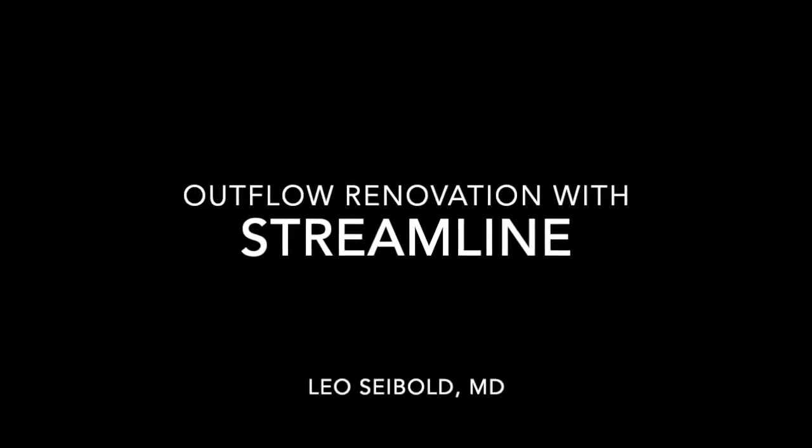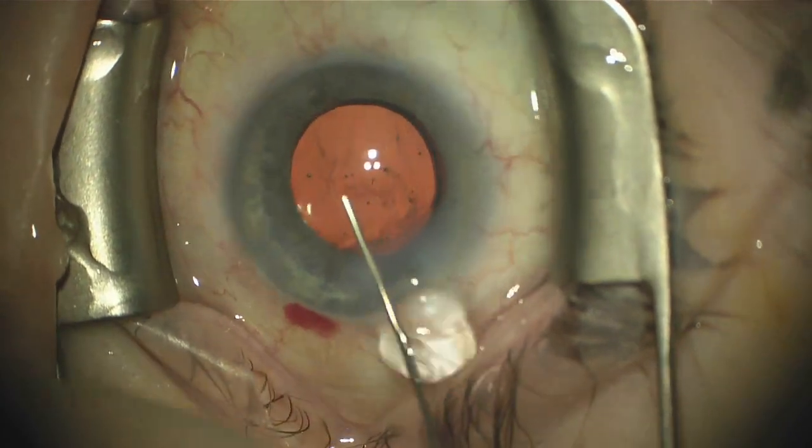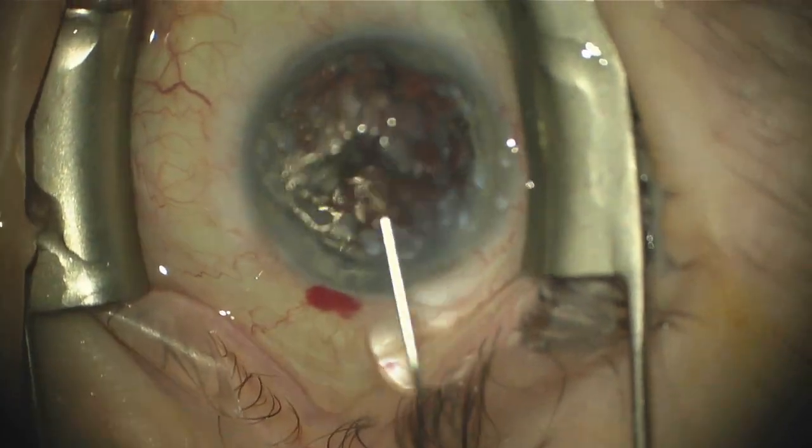This is a case of combination cataract and streamlined procedure that I think really demonstrates the total outflow renovation that you can get.